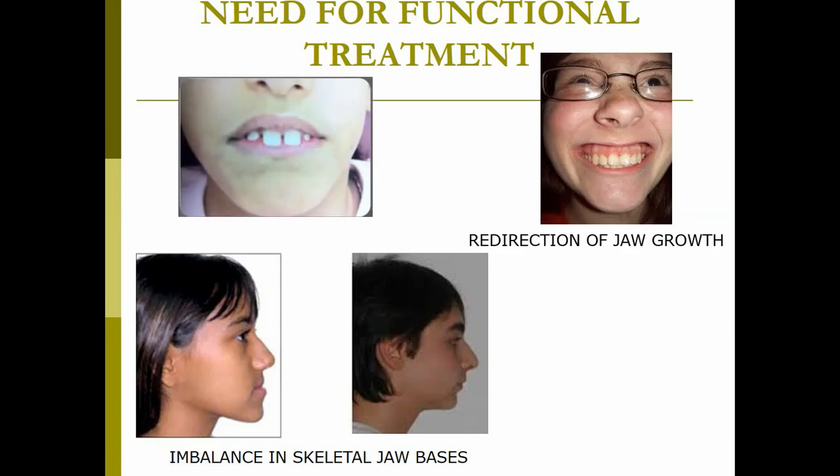Or it can be any muscular habit which needs to be retrained. Like here you have a lower lip trap, a hyperactive mentalis activity. So for this also it is your myofunctional appliances which will be given. So all these are not aiming for your dental movement. It is to redirect your muscles and influence your jaws in turn.